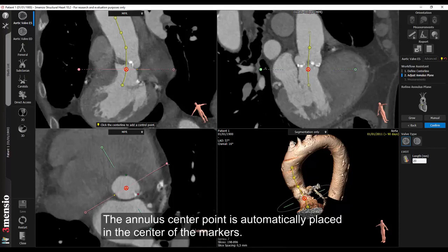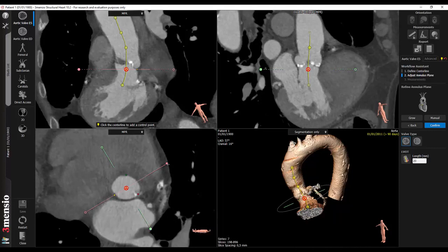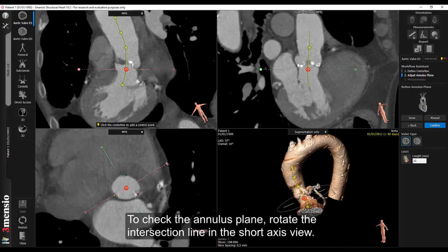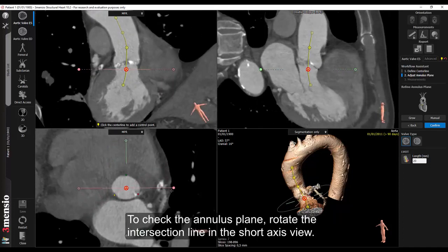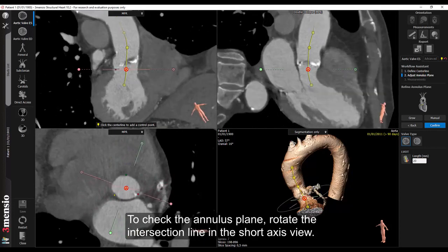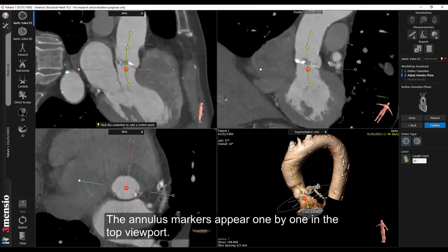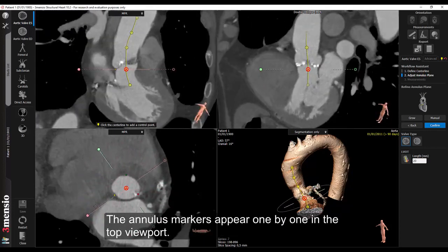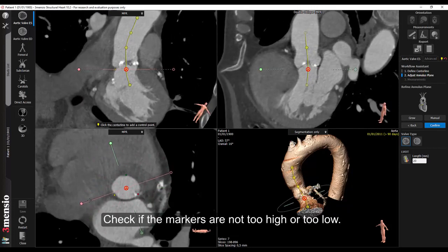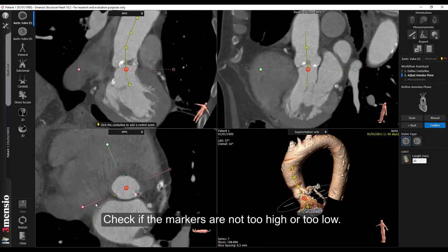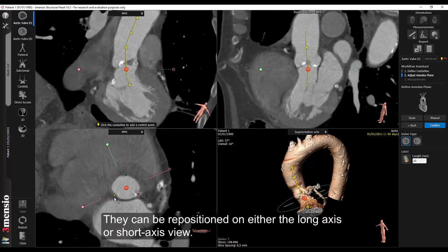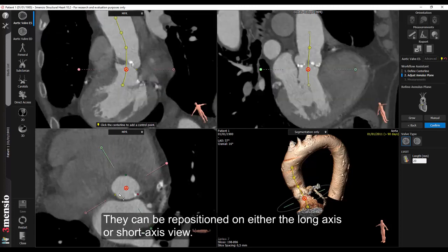Once the three points are defined, the software will automatically define the annulus plane as the plane going through these three points. The annulus center point is automatically placed in the center of the markers. To check the annulus plane, rotate the intersection line in the short axis view. The annulus markers appear one by one in the top viewport. Check if the markers are not too high or too low. They can be repositioned on either the long axis or short axis view.